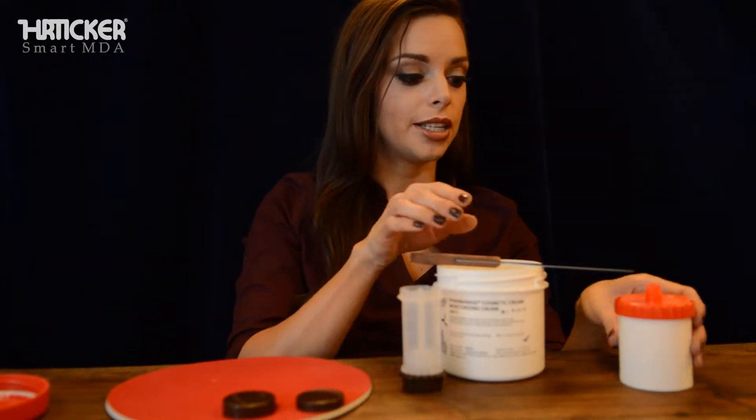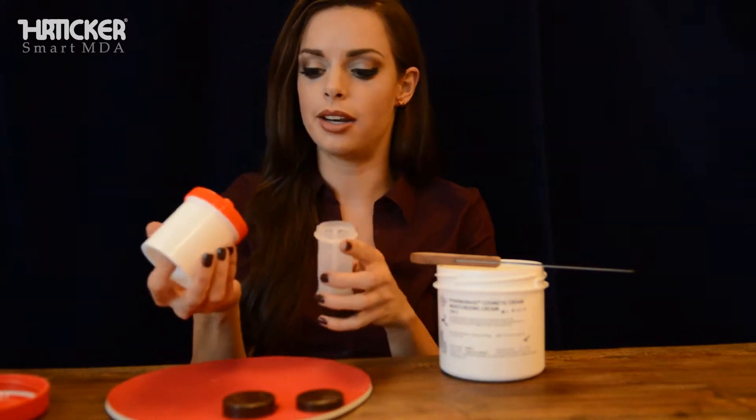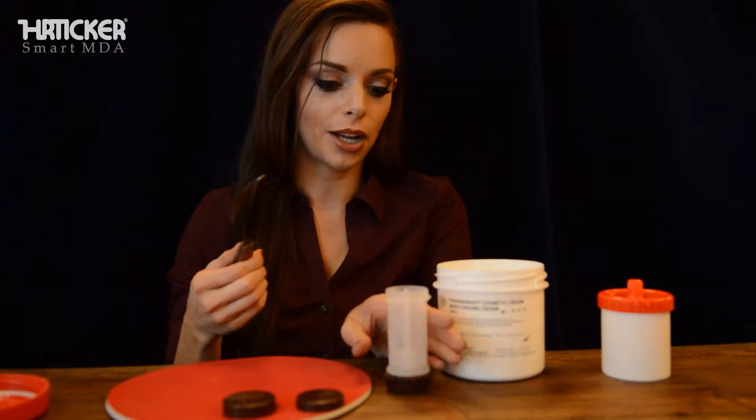Open up your tub of whatever medication you'll be using and you can grab a spatula. The other option is if you have some sort of a dispensing jar, then you can go ahead and dispense it directly into the unit. But for right now I'll just go ahead and grab my spatula.